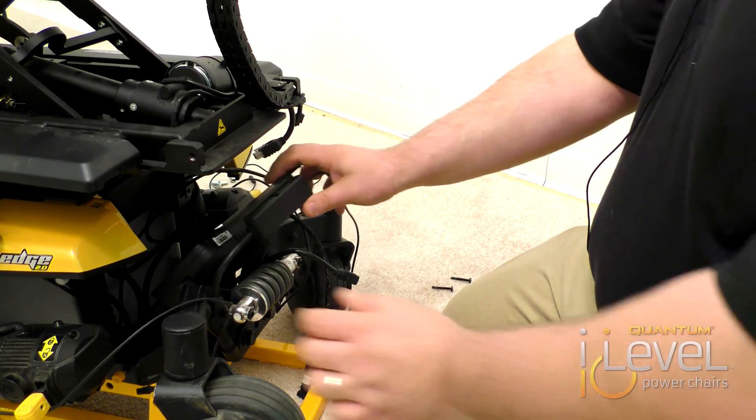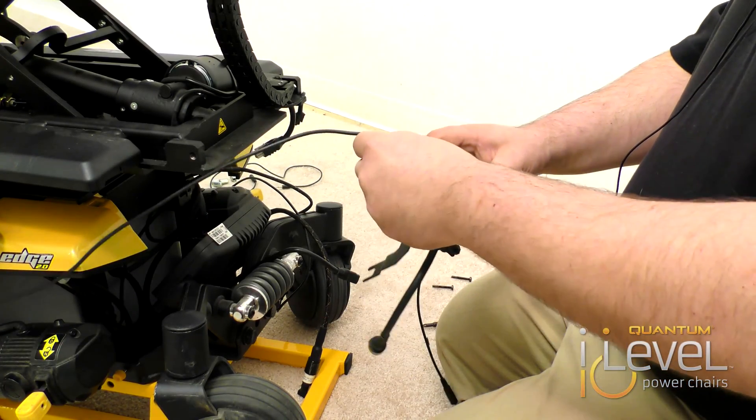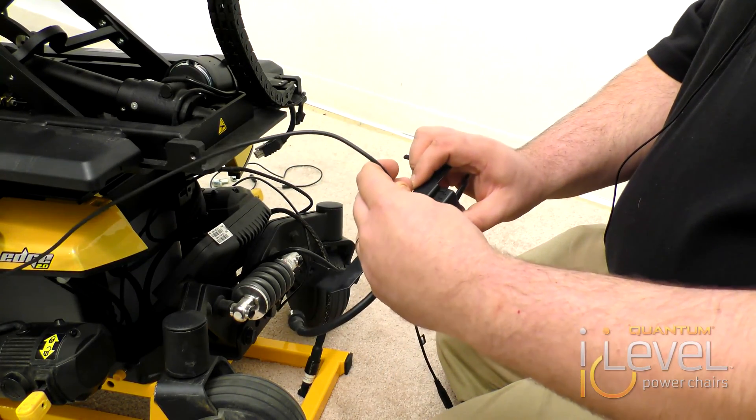It's actually a tight fit. First off, you want to attach your fender lights right in here using the two-pin connectors.